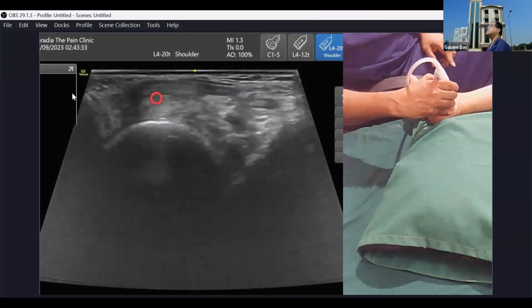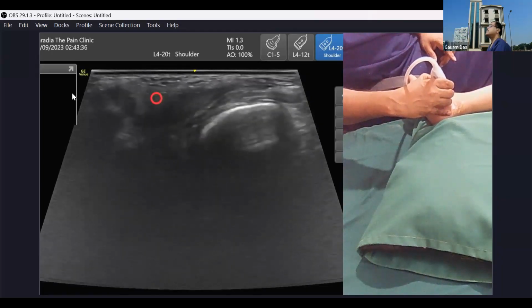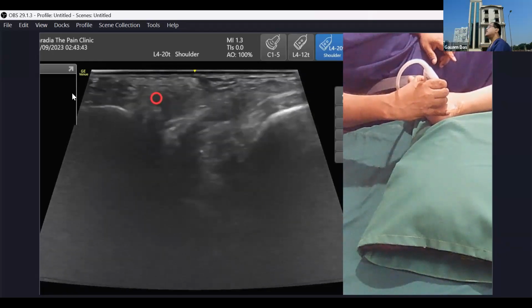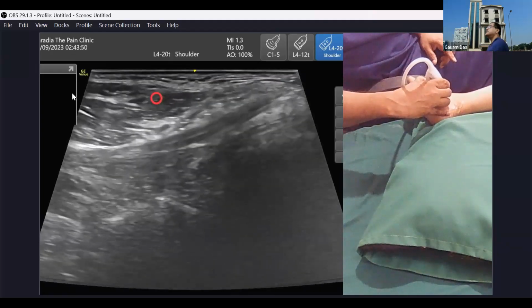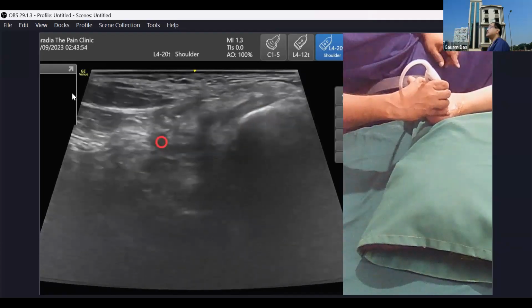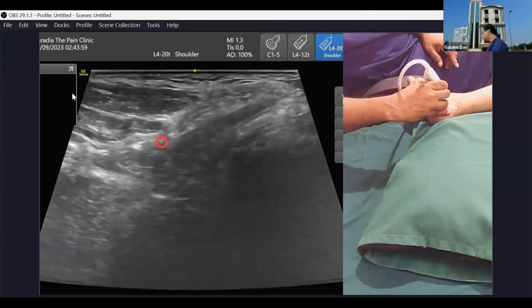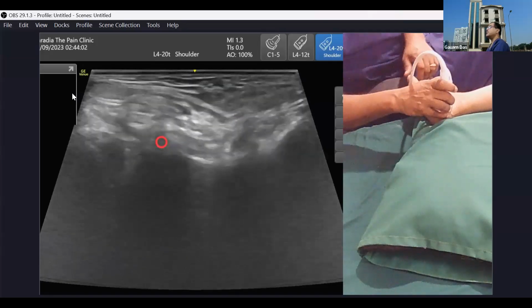And you see where it is coming. It is dipping down and getting attached. Some part is getting attached to the tibialis. Tibialis posterior. So getting attached to the base of the metatarsal bone, sorry.